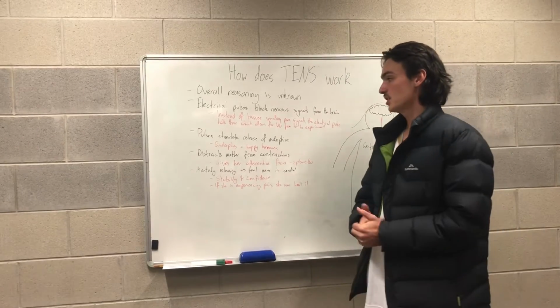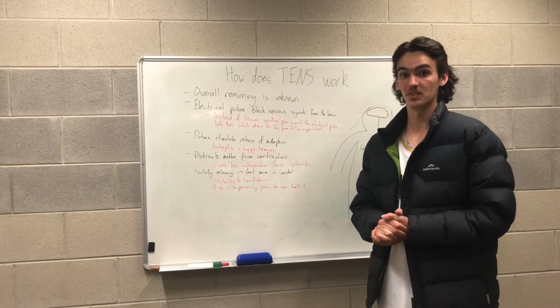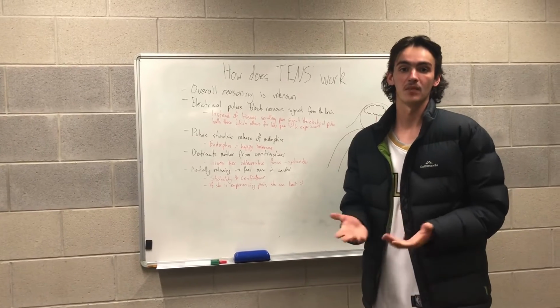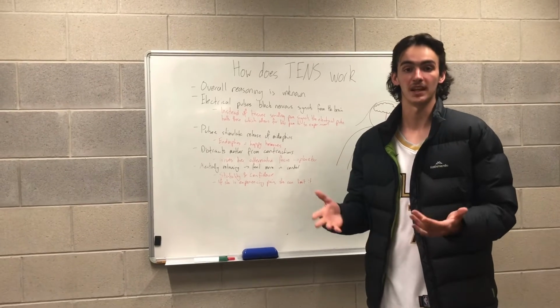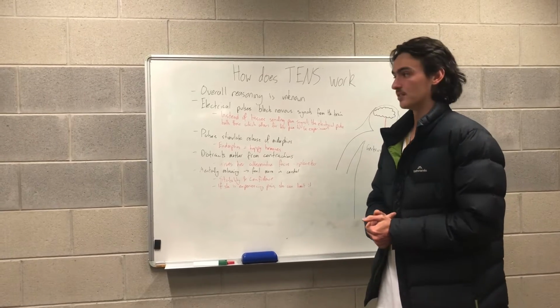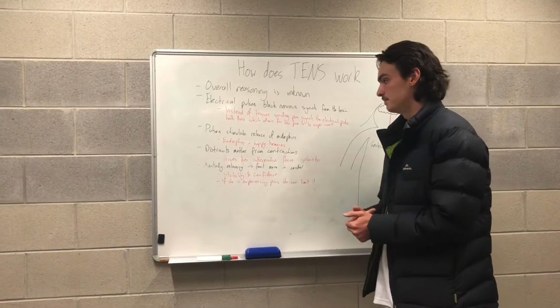Another point to be mentioned is that the pulses of the TENS machine will stimulate the release of endorphins. Endorphins are essentially just hormones that are released to make people happy and make them feel more comfortable, more relaxed, all that sort of stuff that is very crucial to a successful labour, and it's part of the reason why we had so many of the benefits previously mentioned.